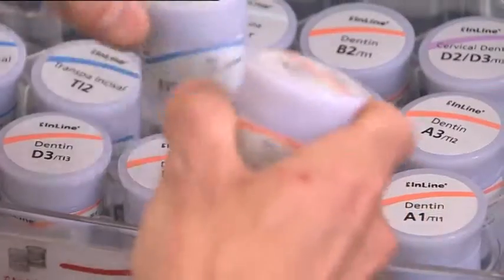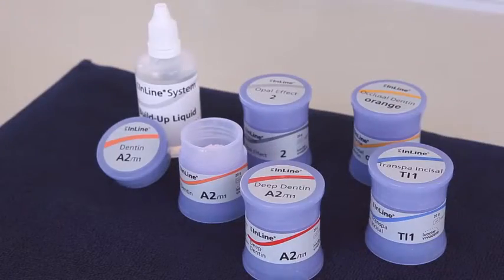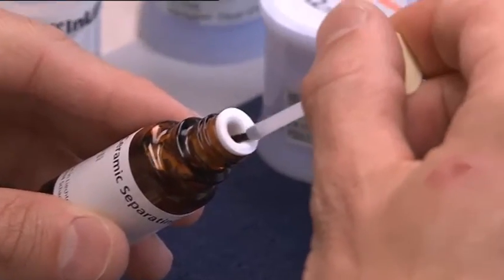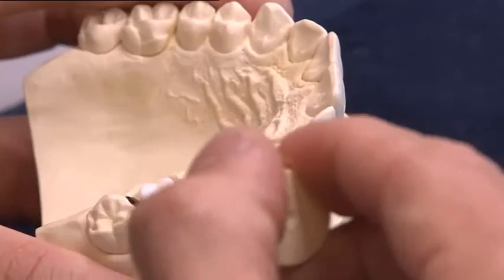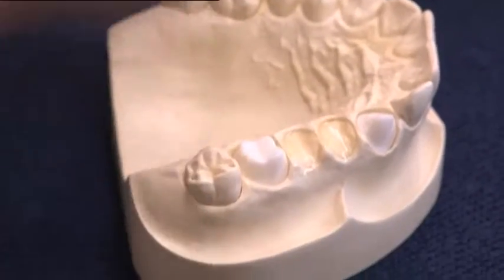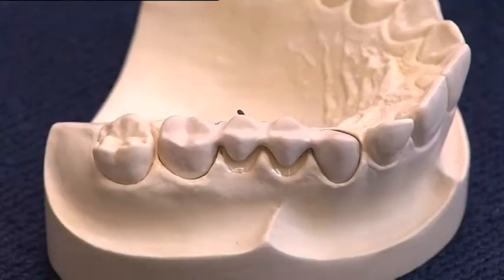Choose the dentin, incisal, and intensive materials in the respective shade and the buildup liquid. For isolating the stone pontic and the adjacent teeth, the IPS model sealer and the IPS ceramic separating liquid are used. Place the opaquerized framework on the model.